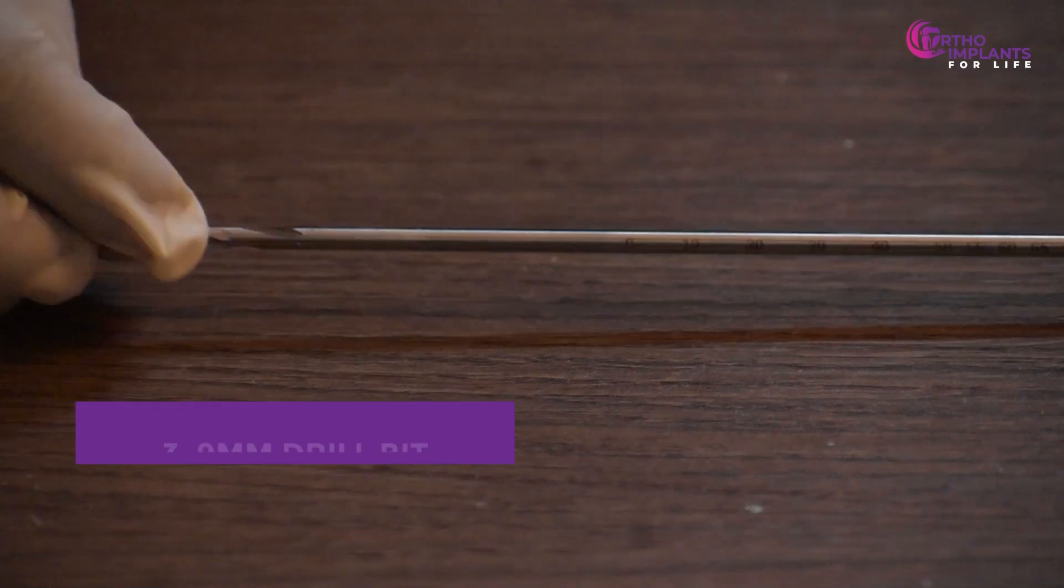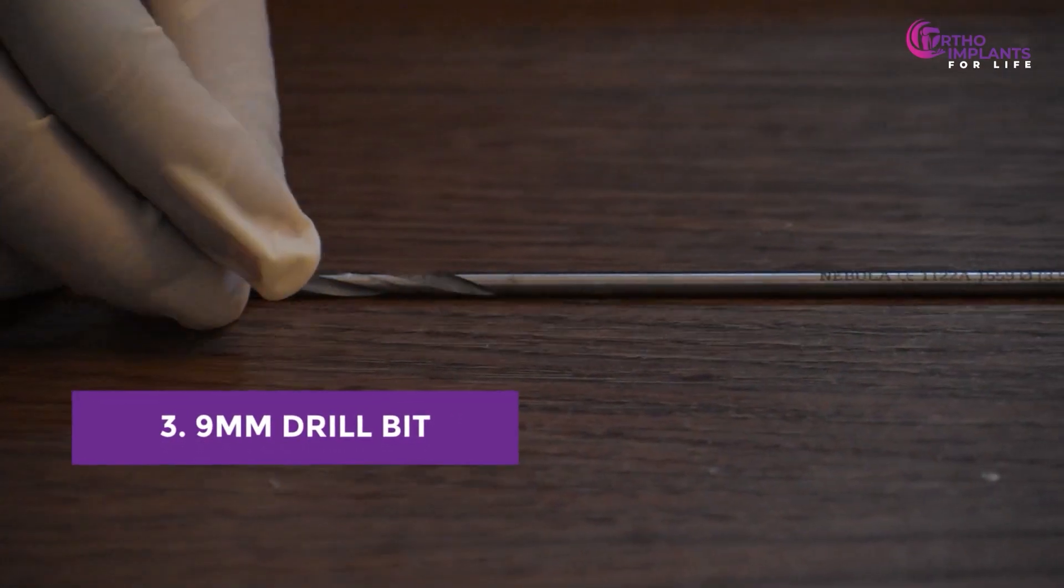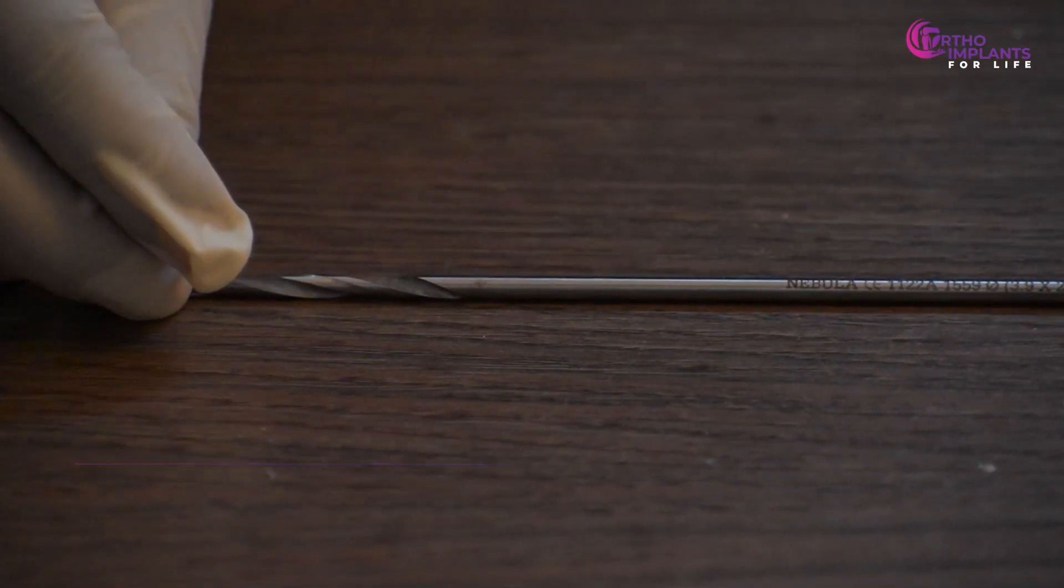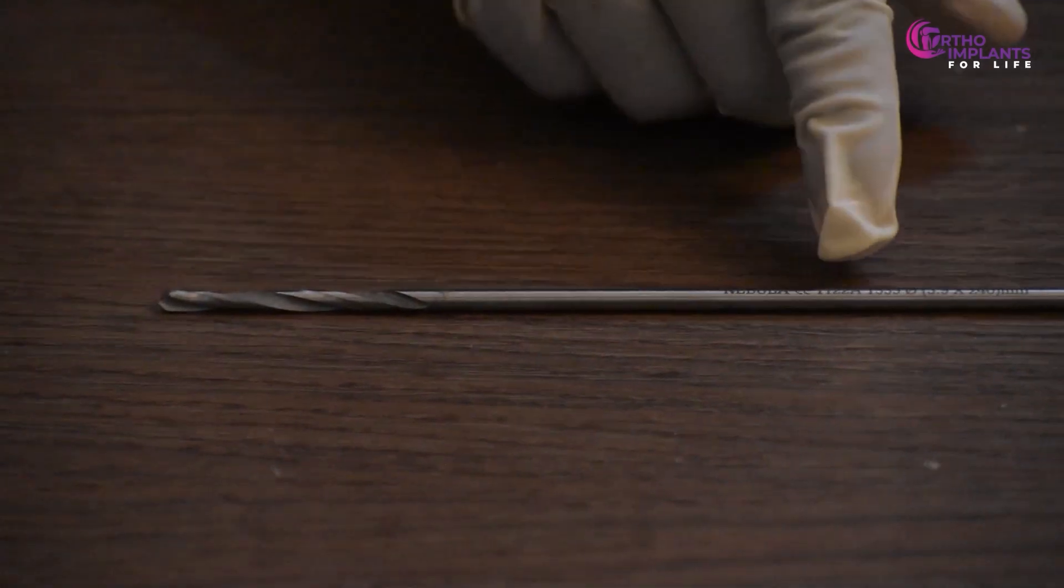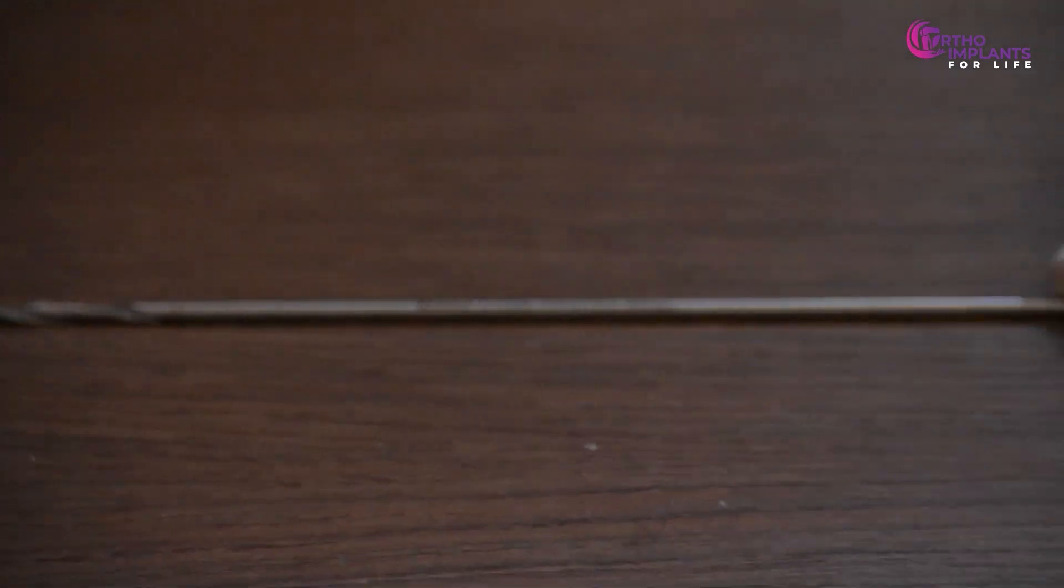Moving on, we have the 3.9 mm drill bit, used specifically for the 5 mm locking plates.